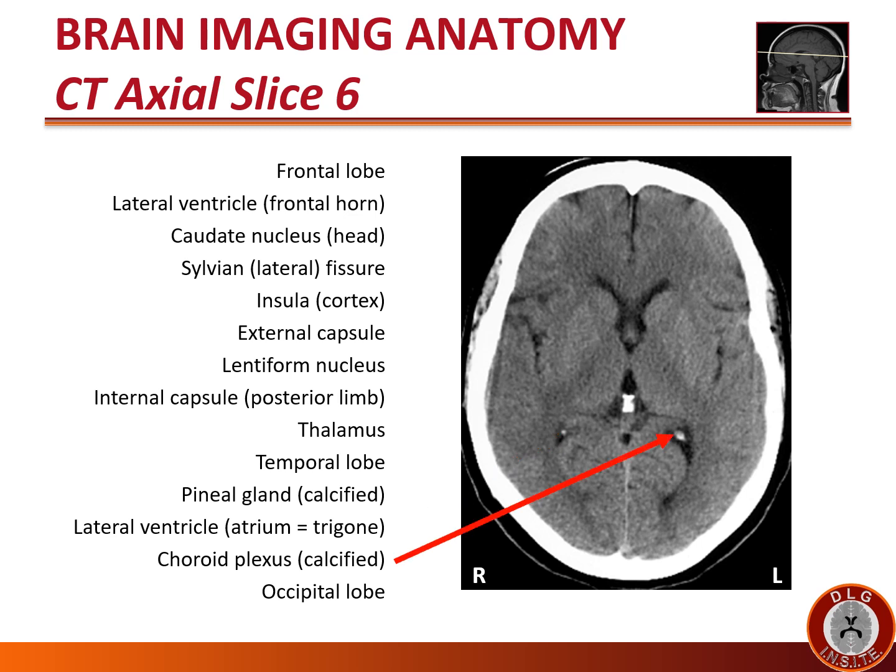In this image we see a white or hyperdense area within the atrium — this is the choroid plexus. The choroid plexus makes cerebrospinal fluid and is commonly calcified, so it appears white on CT scans. It is commonly seen within the atria of the lateral ventricles.